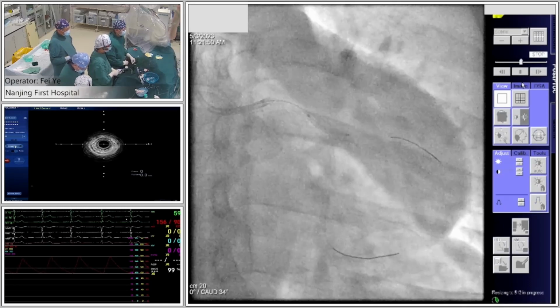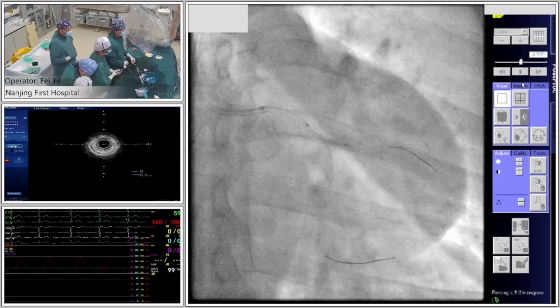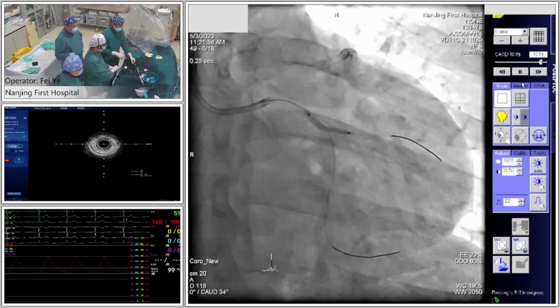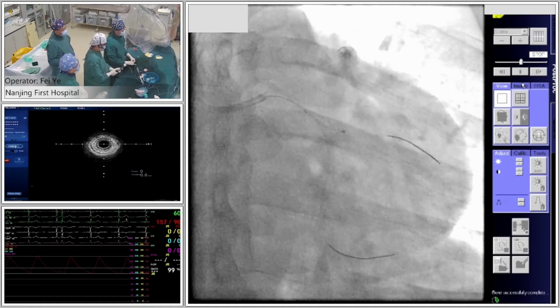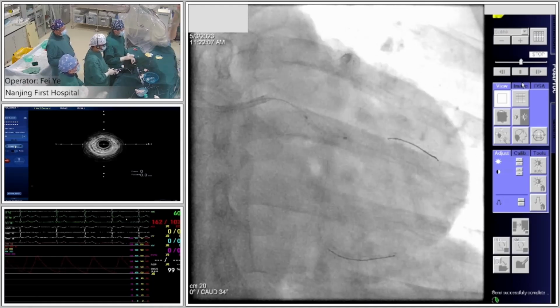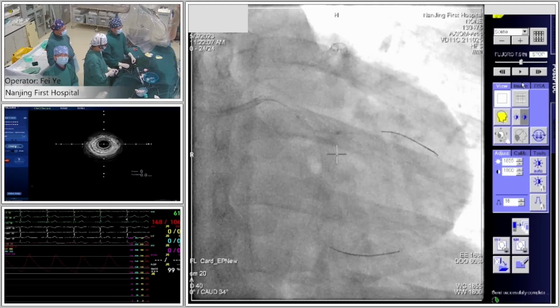Still there is risk. 10, 12. Up. Yeah, we have achieved. Go back to fully open. Okay, 6 again. We want to use a small, lower pressure to maintain it for a long time. 30 seconds.